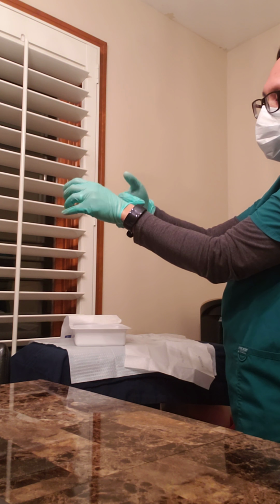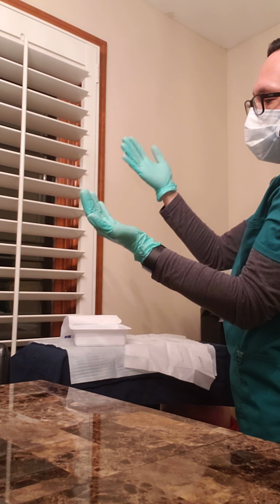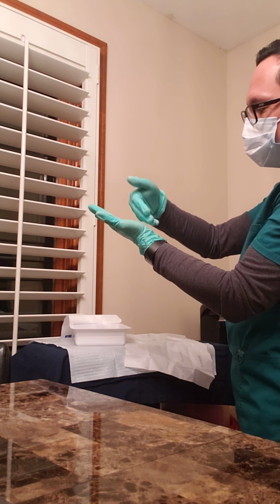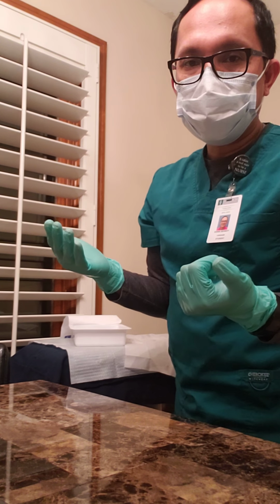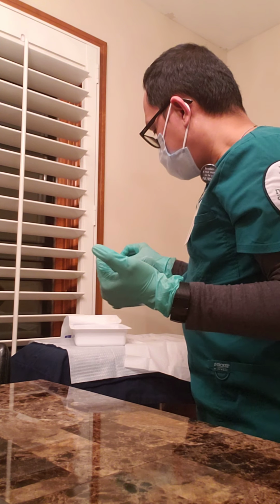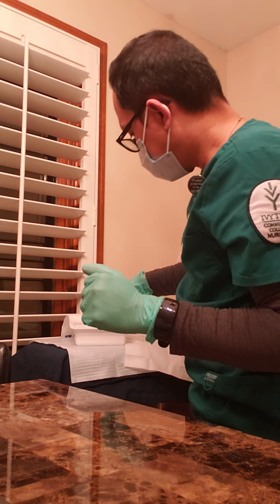With my non-dominant hand earlier, I took it from the inside. Now with my dominant hand, after putting on the gloves, I took it from the outside. At this point in time, now I'm ready to clean the insertion site. First, I'm gonna clean it with an alcohol swab stick.